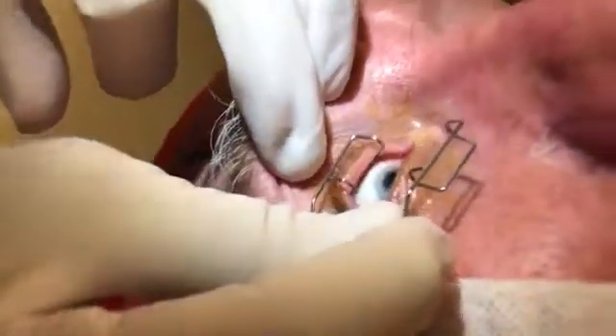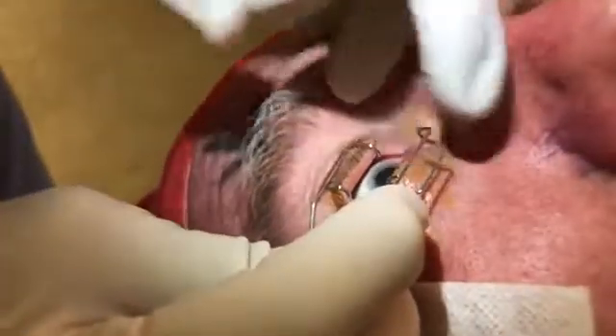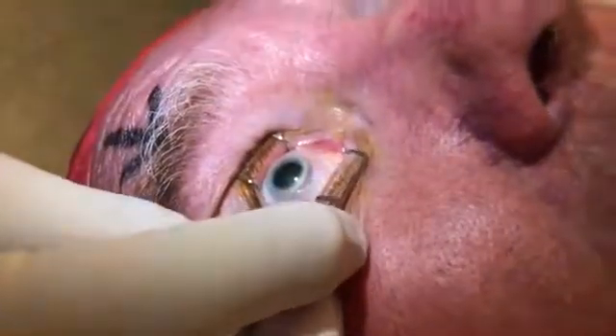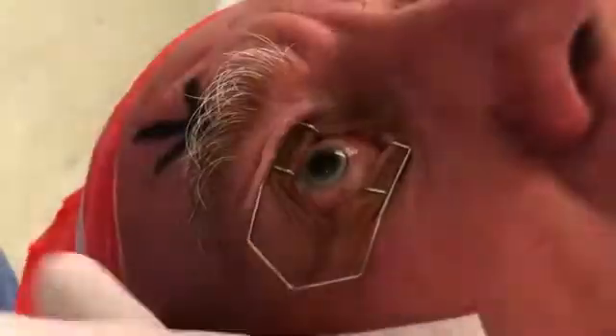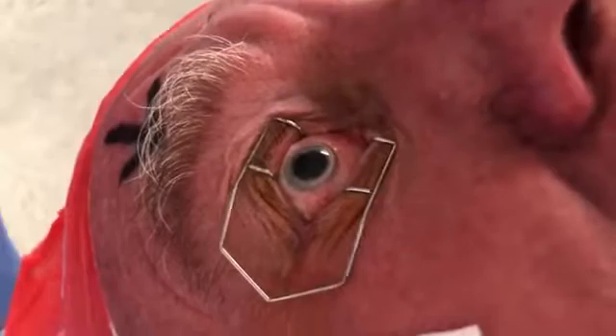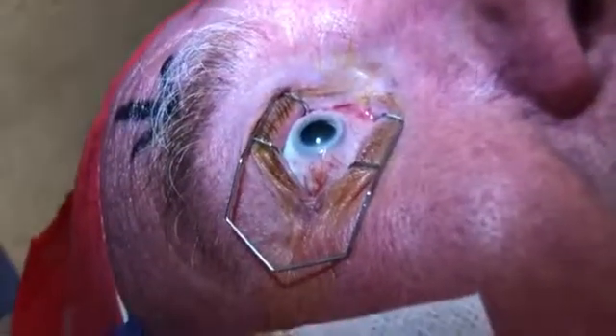Down to your feet, we've got a little clip in to keep your eyelids open. Now look up at my chin, where my chin is. Now you keep looking up at my chin, okay? Well, I'm doing my best, but somebody put a light in my eye. That's me, I'm afraid. So keep looking at my chin.